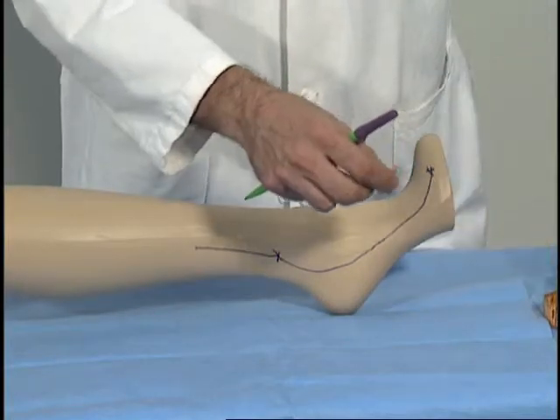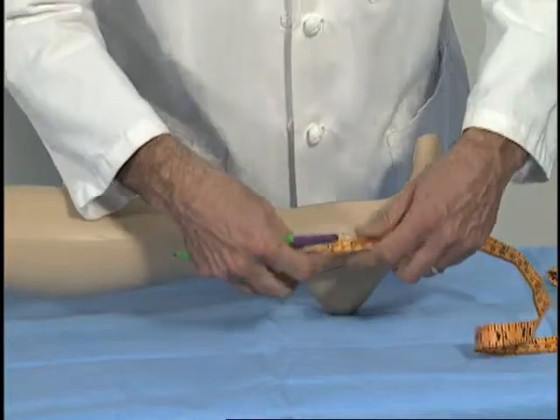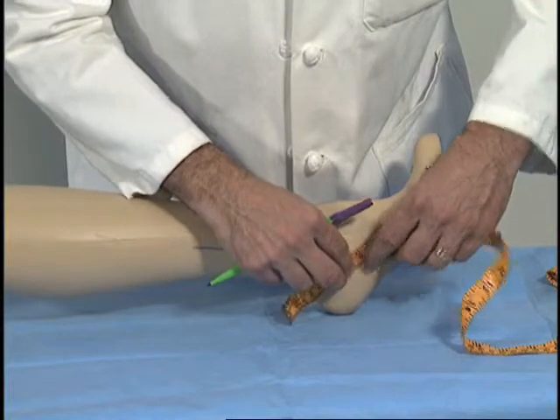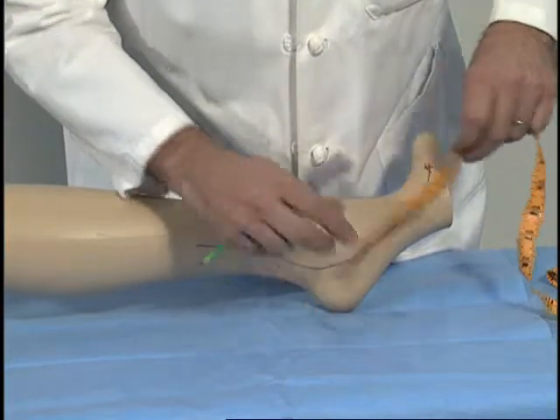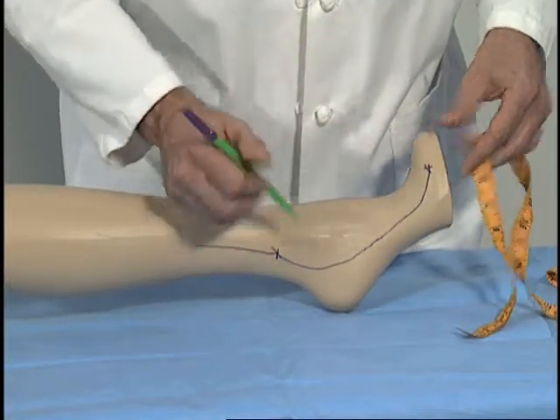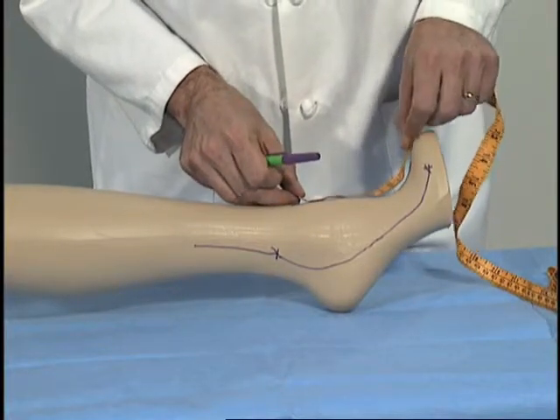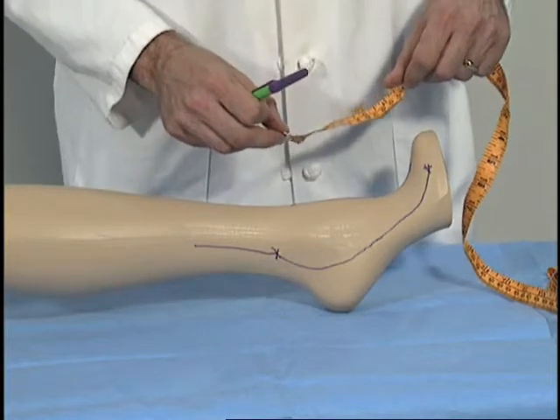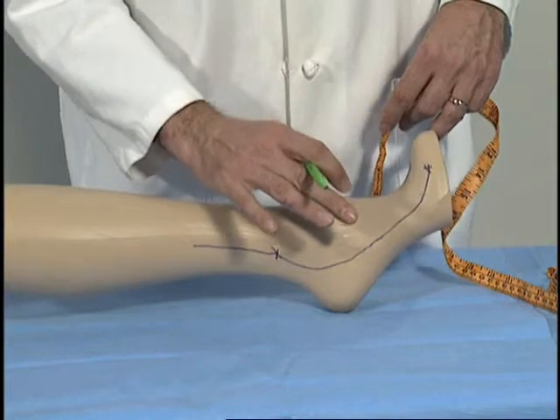We'll bring our measurement in, and in our primary treatment zone, we've got 20 centimeters for the medial aspect, an additional 13 centimeters for the anterior aspect. So we have 33 centimeters in the foot.